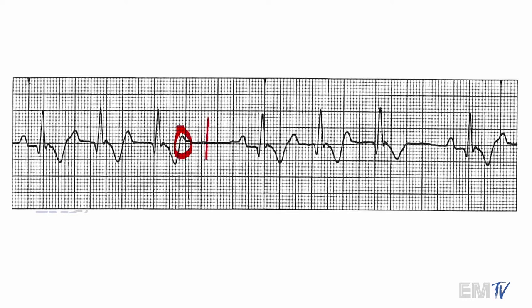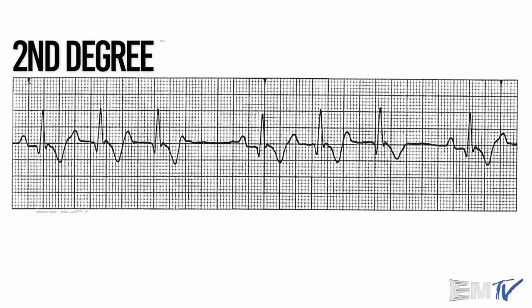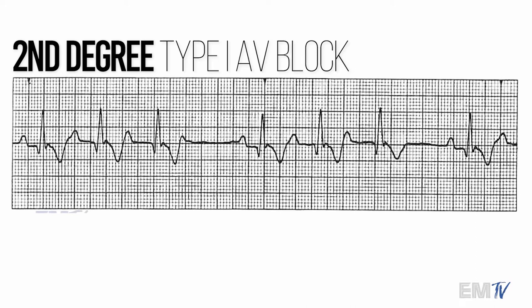Right here, there's a P wave and there's no corresponding QRS complex with it, which makes it one of the second-degree blocks. However, the difference between second-degree type 2 and second-degree type 1 is the PR interval and whether or not it's consistent. So let's go ahead and measure our PR interval. We notice here that the PR interval is actually becoming longer before there's a drop-off in QRS complex. There's only one type of heart rhythm that does this. So I would diagnose this as a second-degree type 1, or a Mobitz 1, or a Wenckebach — it has three different names for it.